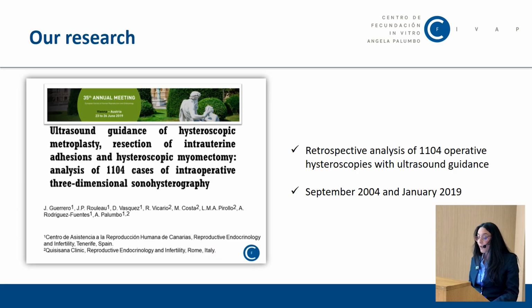Now, in 2019, Dr. Guerrero presented a new study at the ESHRE Congress. This is a retrospective analysis of more than a thousand patients who underwent operative hysteroscopy for uterine malformation, submucosal myoma, and intrauterine adhesions.